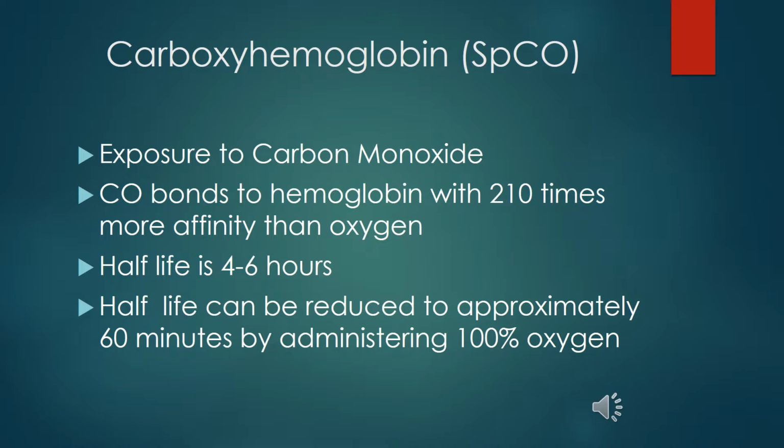Shifting gears to one of the other parameters monitored on the LifePak 15, we're going to talk about carboxyhemoglobin, or SPCO, and it is from exposure to carbon monoxide, such as a fire or exhaust fumes. Carbon monoxide has the affinity for hemoglobin that's 210 times stronger than oxygen's affinity.